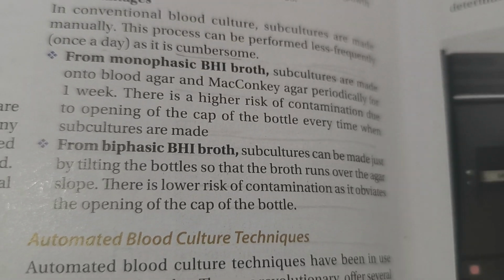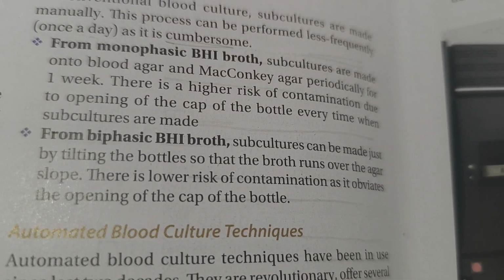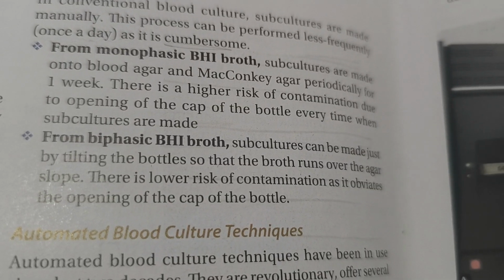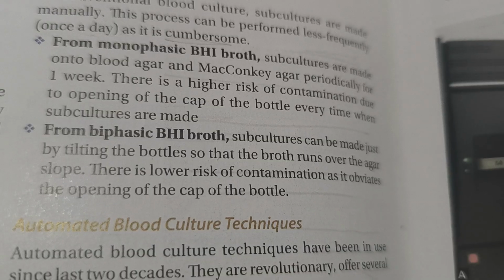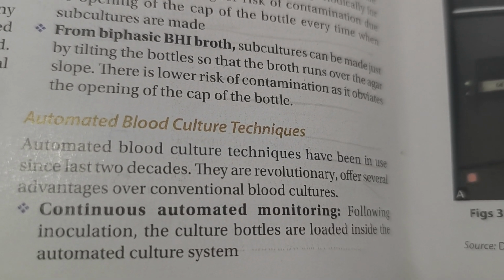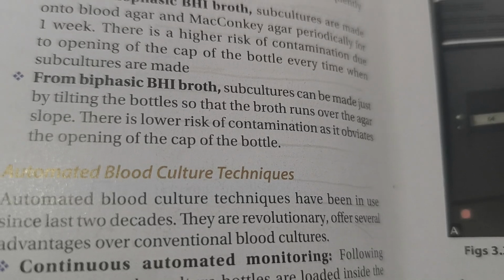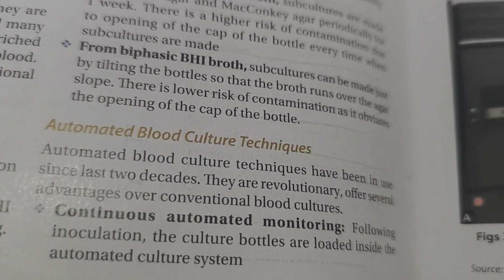There is high risk of contamination due to opening of cap of the bottle every time when the subcultures are made. From biphasic BHI broth, subcultures can be made just by tilting the bottles so that the broth runs over the agar slope. There is lower risk of contamination as it obviates the opening of cap in the bottle.